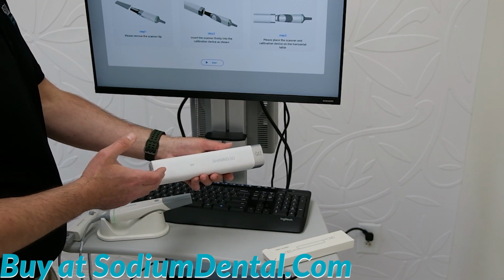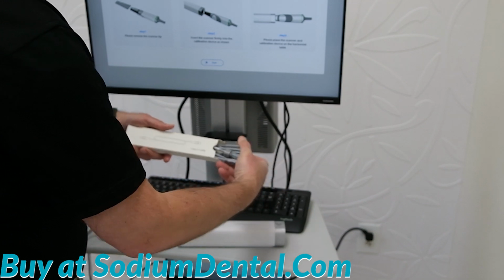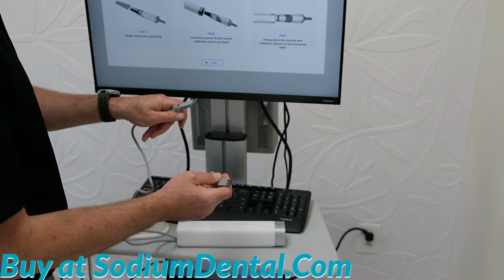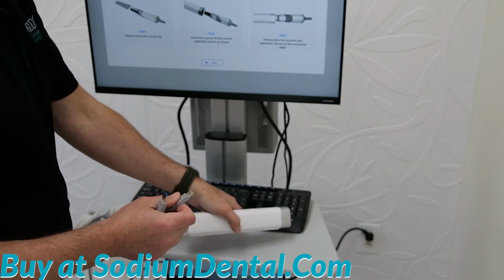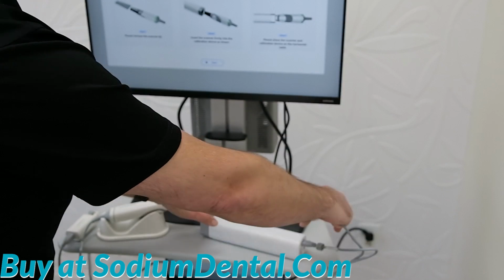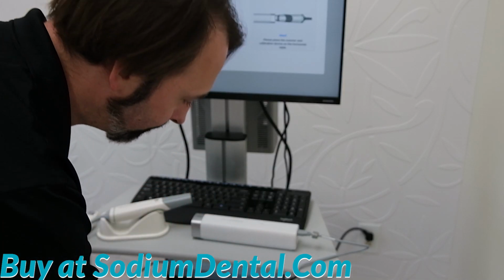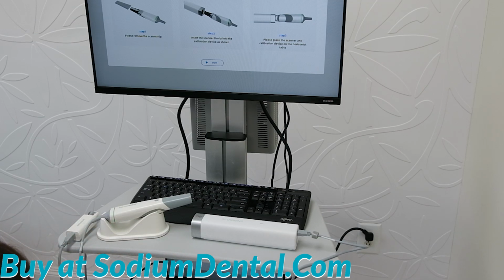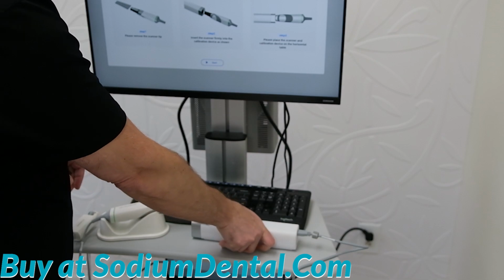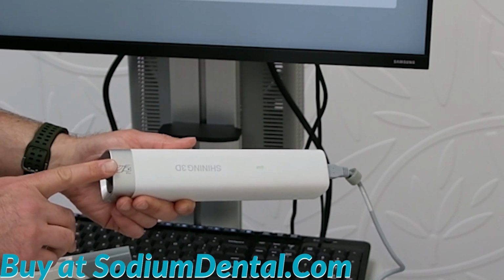This is your scanner calibration block. You will find this USB cable inside your kit. You notice it has two USB-A connectors. Take one of the connectors and plug it into the back of the calibration block. Take the other end and plug it into a USB 3.0 port on the same computer as your scanner. Now, observe the calibration block shows you exactly how to plug the scanner in.